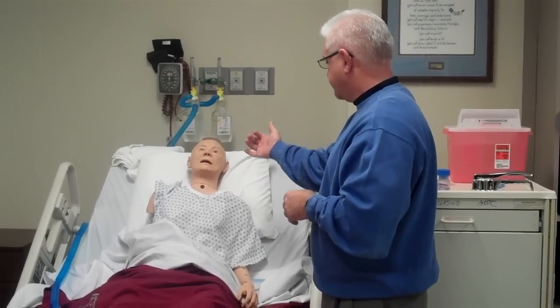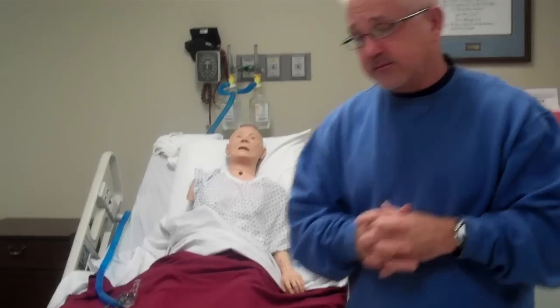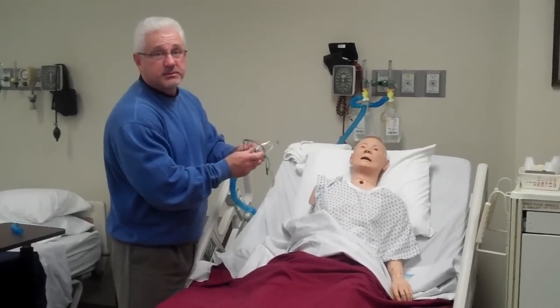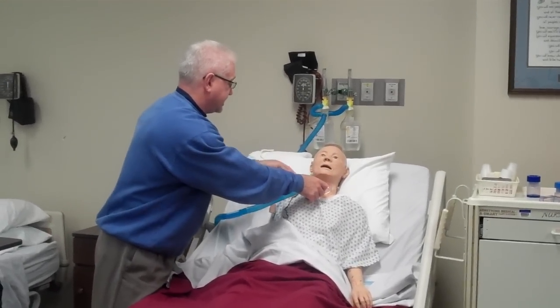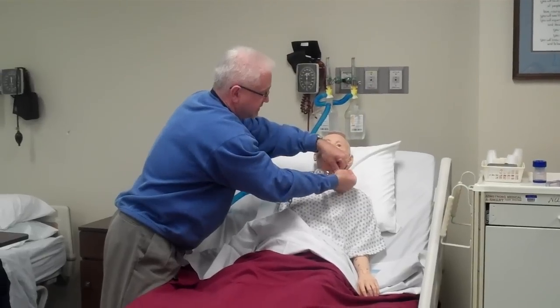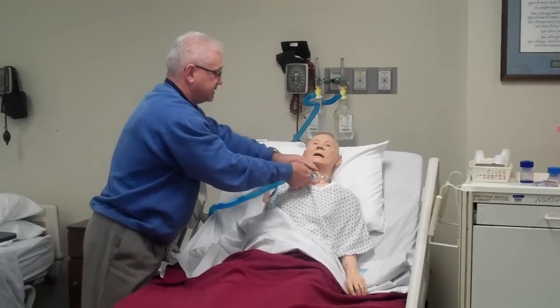If the patient was able to respond, they would give me a level of dyspnea. For color, I'm going to look at the patient's lips, face, and nail beds to see if there's any cyanosis. After completing the patient assessment, I would get the oxygen on the patient — I would never delay that and would get it on as quickly as possible. Even if only one bottle was set up, I'd put it on with one bottle, then set up the second. But since I already calculated that this patient needed at least two bottles — 20 liters per minute total — to have plenty of flow, I was able to do that up front.